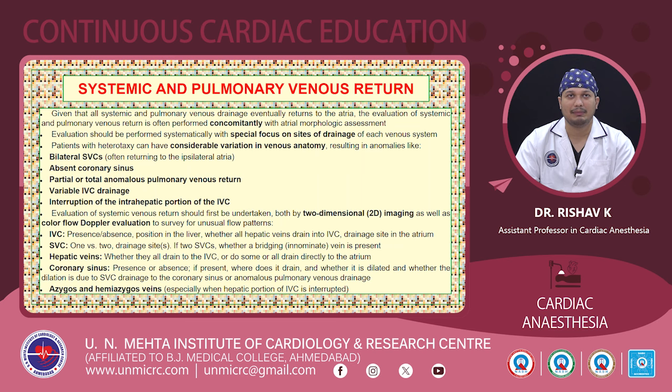Now coming to the systemic and the pulmonary venous return. We have to take into account that the systemic and the pulmonary venous drainage eventually returns to the atria, and therefore it can be performed concomitantly with the atrial morphologic assessment. The evaluation should be done systematically with special focus on sites of drainage of each venous system. Like I have told, we cannot assume anything with regard to the anatomy, and we have to focus on where the great vessels are emptying into each cardiac chamber, so as to determine whether or not the venous return to the heart is normal or abnormal.